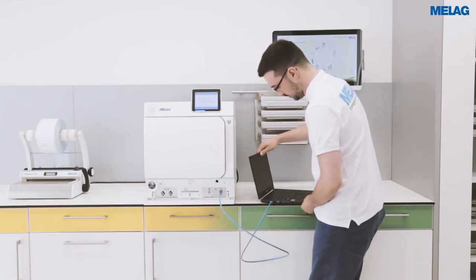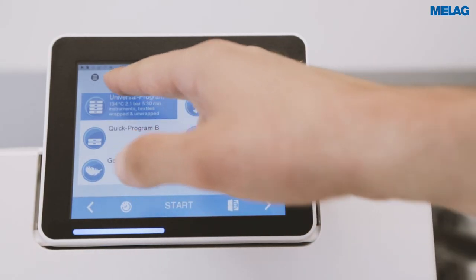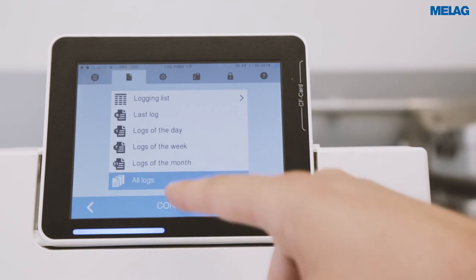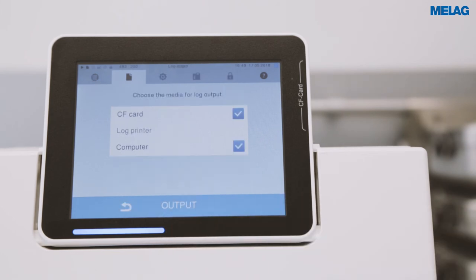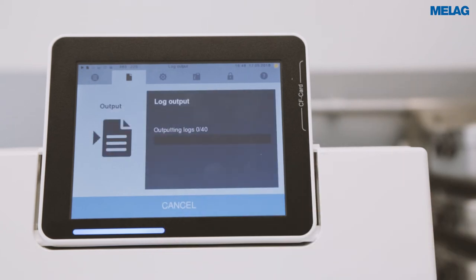To issue the log files to a designated output media, you have to access the logging menu — this is the second button from the left side. Now you have to go to all logs and then continue. Here you can choose the output media you want the log files to be issued to. You can choose CF card and computer and then press output. You will see a little window which tells you how many logs have already been transferred.